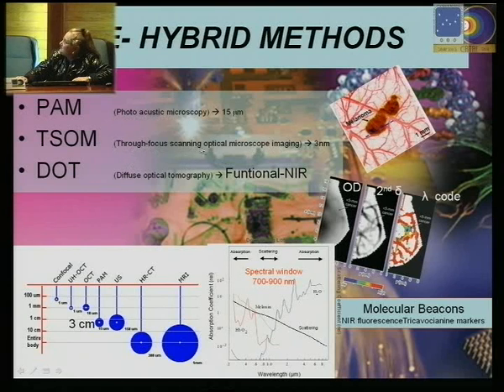This is the through focus scanning optical microscope imaging. It's just subtracting images in different Z positions. Obviously, in a very nice and very precise scanning system on Z position, but it's let's say it's a very stupid method, and they get very good results.